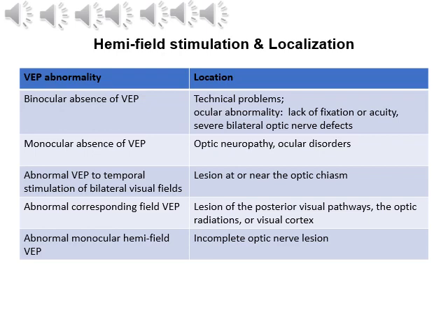Moving down to line 3, if an abnormal VEP is seen to temporal stimulation of the bilateral visual fields, so we know that the bilateral temporal visual fields cross over and activate the nasal fields. And so the nasal fields are the ones that cross over at the optic chiasm. And so if we see that there are abnormal VEPs when we stimulate the temporal visual fields, then we know that it's a nasal retinal field problem, and so the lesion would be at the optic chiasm.